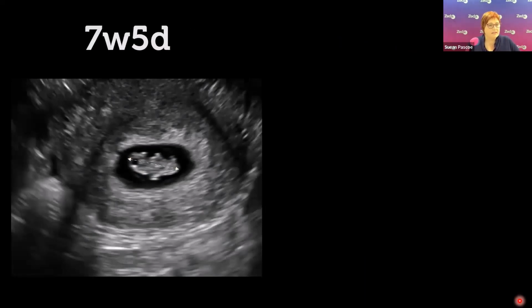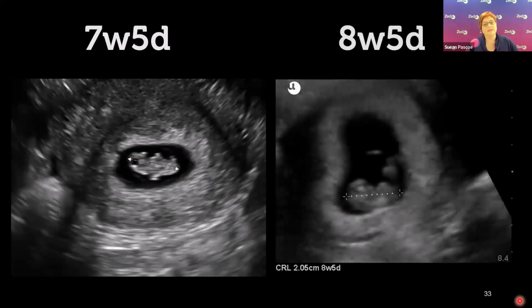7 weeks, 5 days, there's a little bit more substance to baby. It's much easier to see the fetal heartbeat at this stage. At 8 weeks, we start to see limb paddles. Now, in this view here, you can also see the amnion, that very thin, curvy line. It's a very thin membrane, so we only see it when we're exactly perpendicular to it.